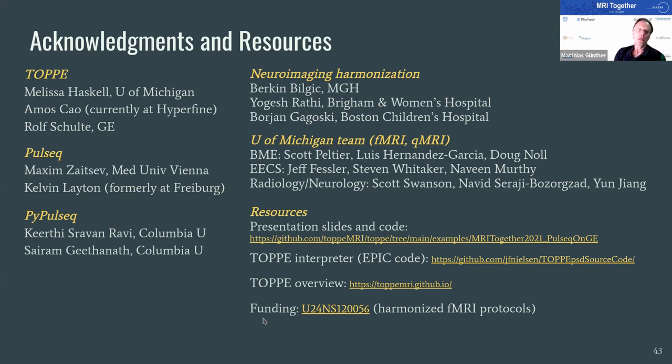Do you have plans on getting the image reconstruction directly on the scanner so that you could see the images without moving the data? I don't have immediate plans. It may be for specific applications. I think that we will need that. For example, for neuroimaging, I think it's pretty clear that to really make it useful, we want to leverage Orchestra, which is GE's recon platform. And I think that's totally doable. We produce a data file, and that can be handled in the same way that you handle data files produced with built-in sequences or other research sequences. So I think it'll be driven by the application. For fMRI, we may be able to achieve a lot just with offline recon.